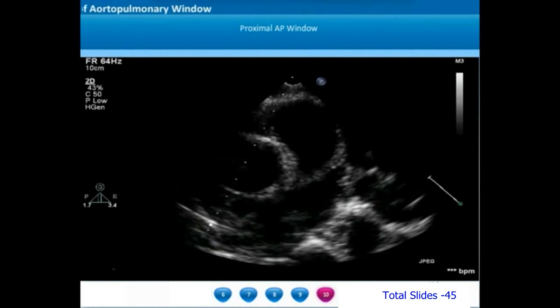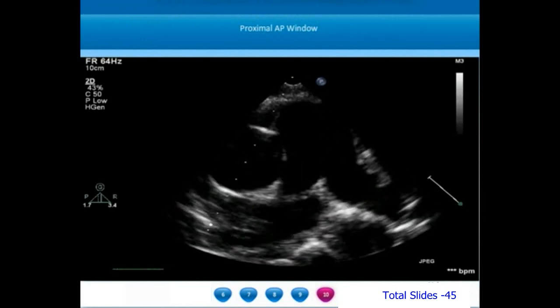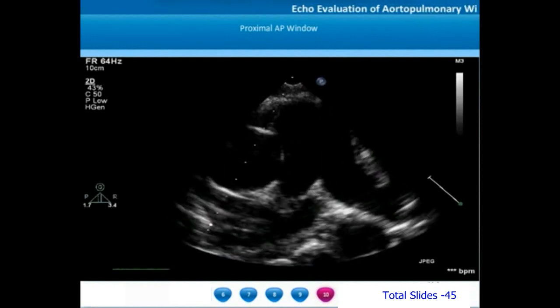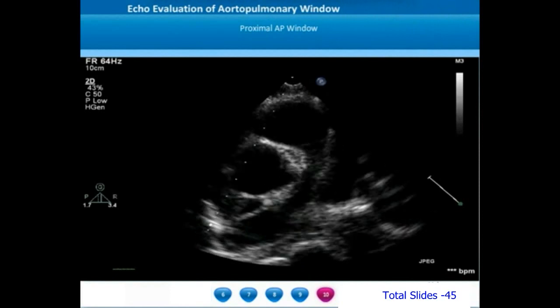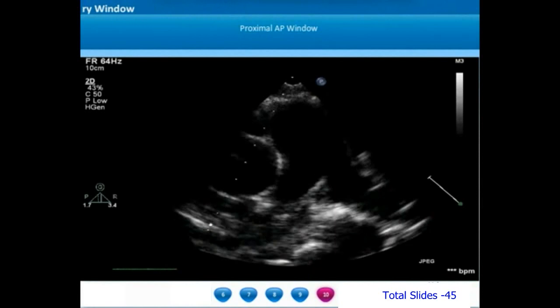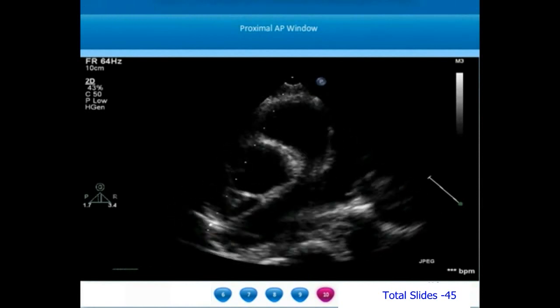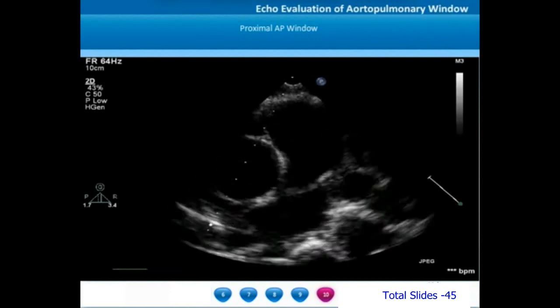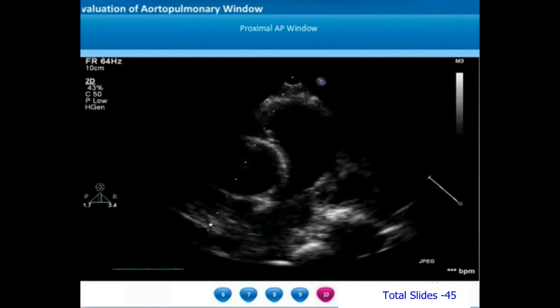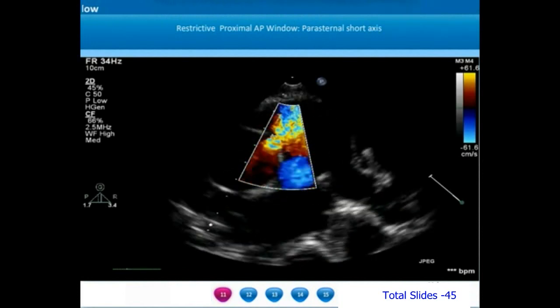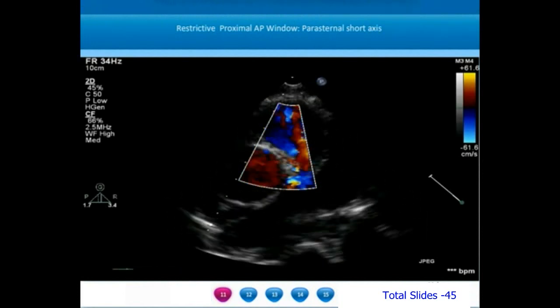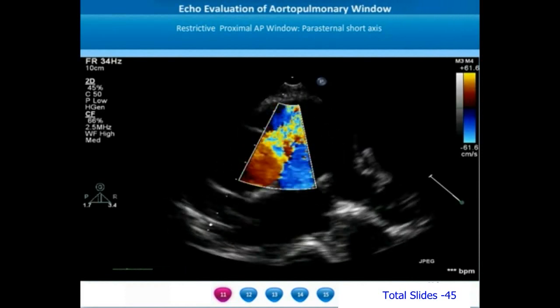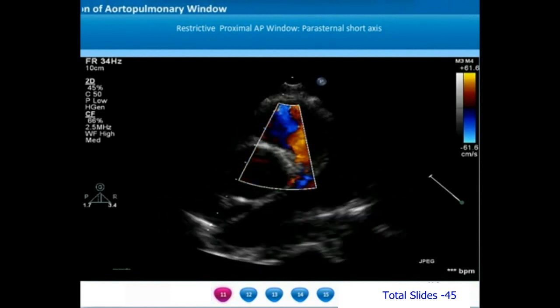In the example with unexplained left atrial and left ventricular dilatation, on parasternal short axis view, we observe the ascending aorta and the main pulmonary artery bifurcating into the right and left pulmonary artery. When we carefully look at the aortopulmonary septum separating the ascending aorta from the main pulmonary artery, we notice that very close to the transducer, close to the pulmonary valve, there is a small defect that appears in certain phases of the cardiac cycle. When interrogated with color flow Doppler, we can appreciate a flow of blood from the ascending aorta into the main pulmonary artery very close to the pulmonary valve — this is an example of proximal AP window.